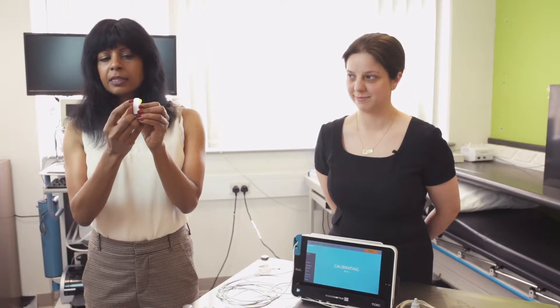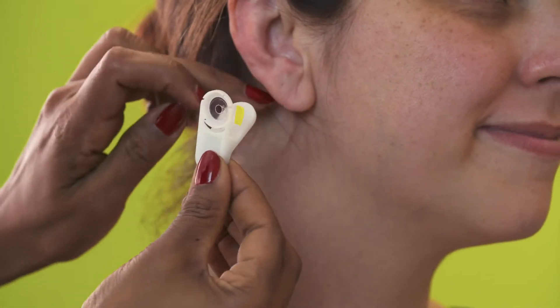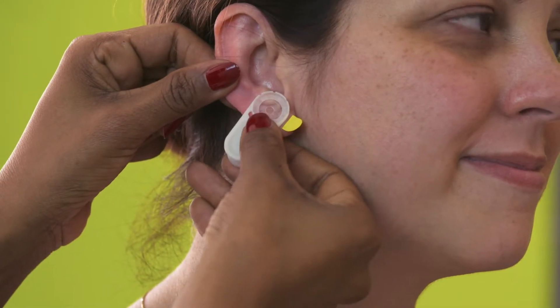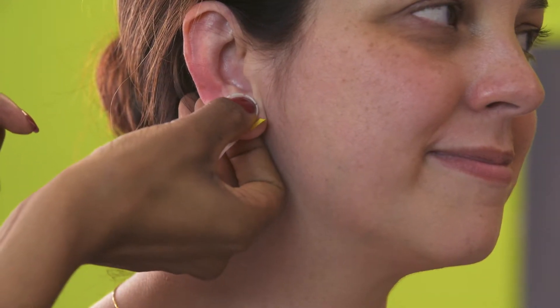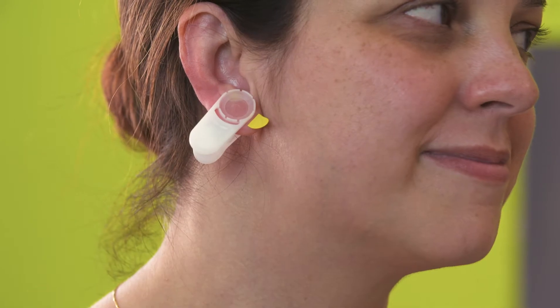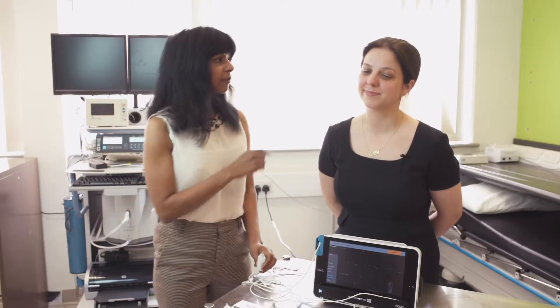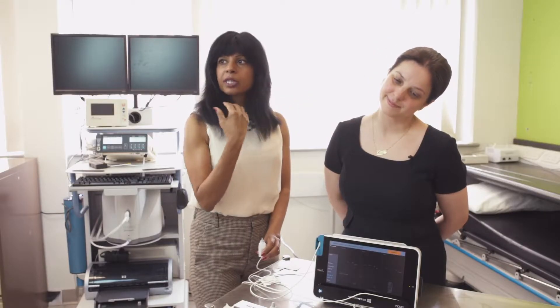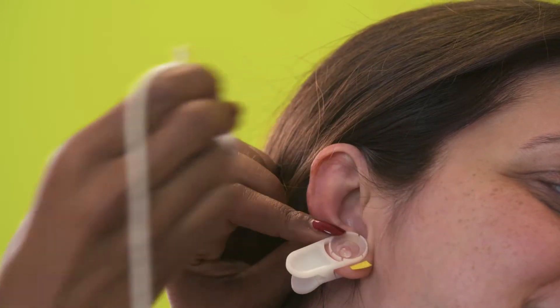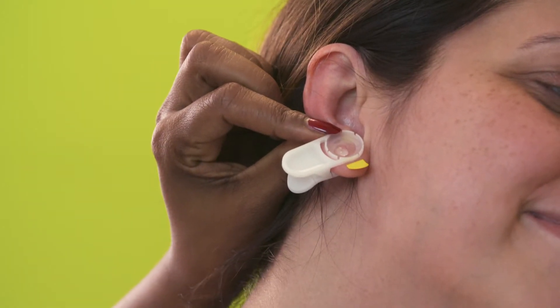What you want to be seeing is this surface with a well facing towards you. This surface here is sticky and that allows me to attach it to Amna's ear. I'm now going to pinch on either side to make sure that there is good contact with the skin. I'm now going to place the contact gel in the ear clip, aiming for the centre hole, but it doesn't matter if the gel expands into the well. It helps if Amna tilts her head away to avoid the gel running out. It's better to put a few more drops of contact gel than too little, as we need the gel to ensure adequate recording.